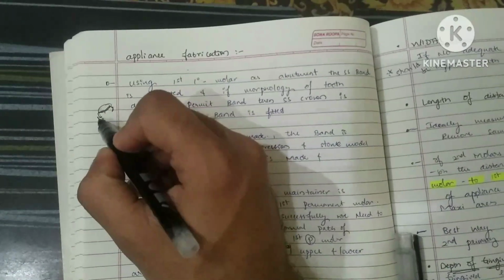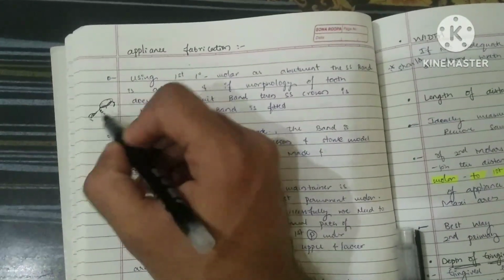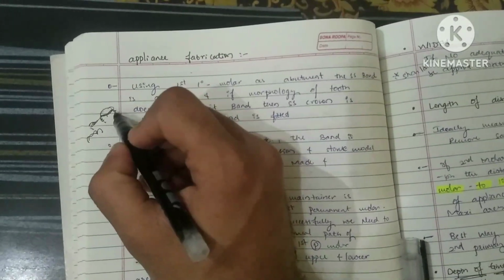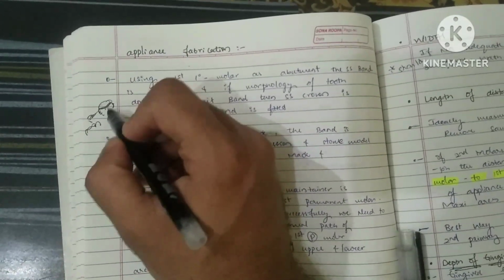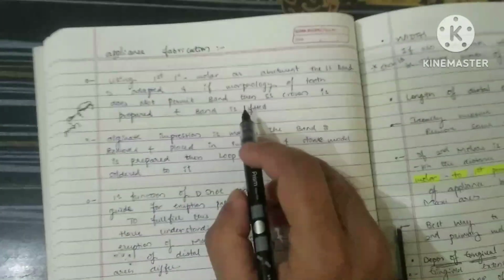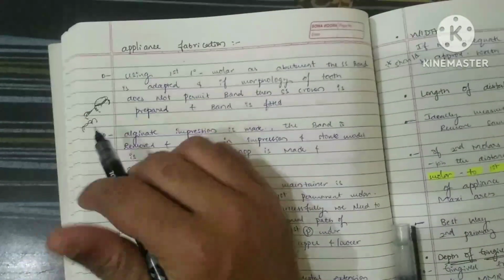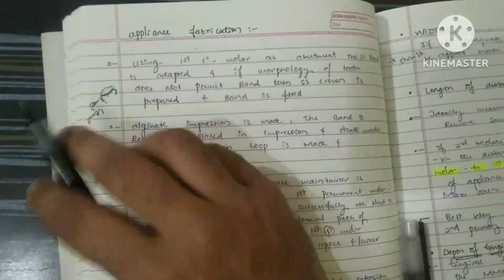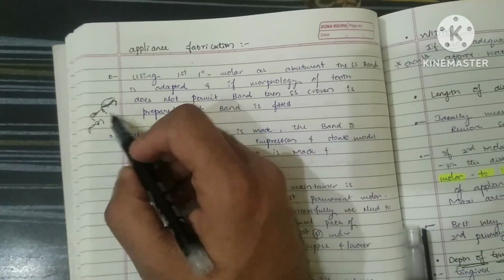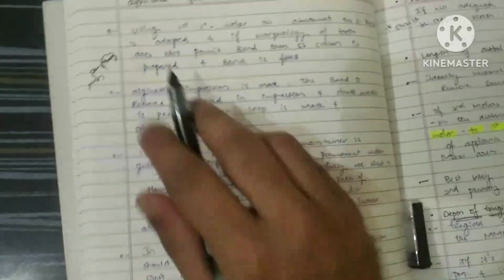Since the second primary molar is missing, and this is the erupting first permanent molar, we are going to prepare the abutment and fix the band over it. But if the morphology of this primary molar is not suitable, we are going to modify it using crown tooth preparation, and then the band is fitted. This is the first step.